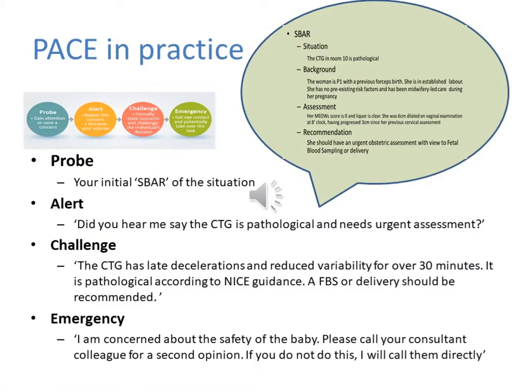An example of PACE in practice. Your probe would be your initial S-bar of the situation. Consider the pathological CTG from the previous slide, that we used S-bar to communicate to our colleague. In this scenario, the midwife has used S-bar to communicate her recommendation that an urgent obstetric assessment is needed.